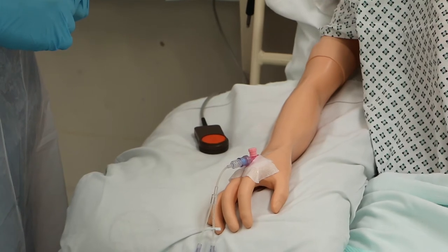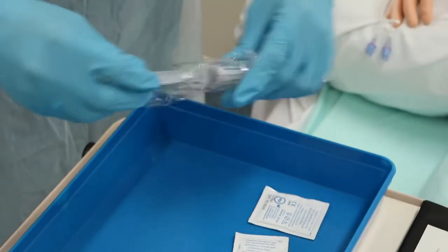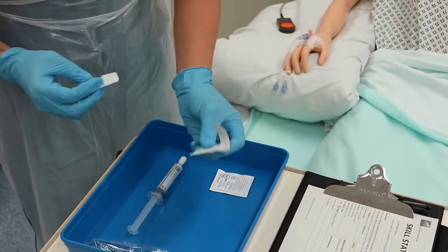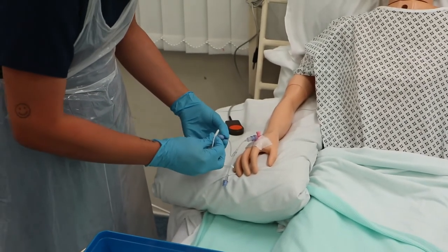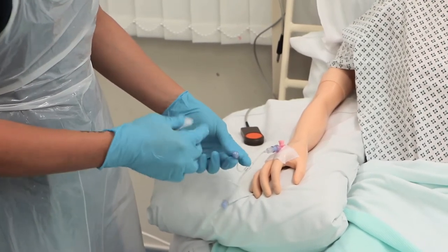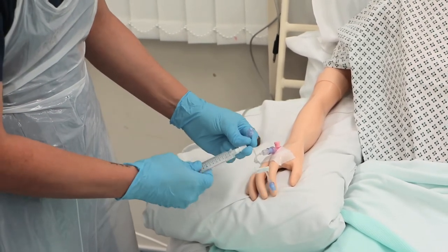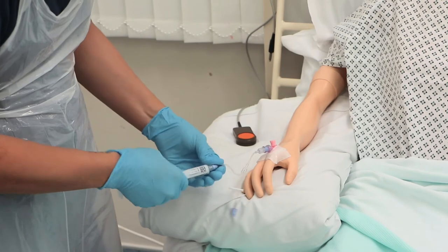Now I'm going to proceed with the cannula flush. I'll start by opening my Posse flush — the wrappers go to the domestic waste bin. Next, I'll clean the cannula port using an alcohol swab in a circular motion from inner to outer for 30 seconds, then let it dry for another 30 seconds. Now I'm going to attach the Posse flush using an aseptic non-touch technique and flush the cannula in a pulsating manner.